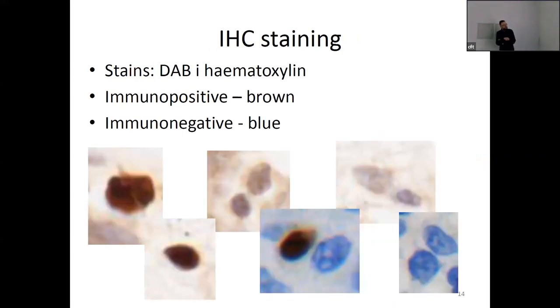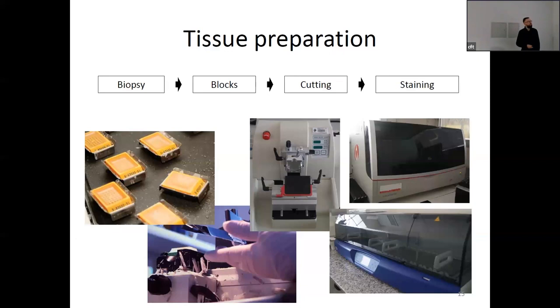And these are the samples from the images from my PhD that we have the stains of DAB, this is the brown marker, and hematoxylin, which is the blue marker here. So we have the brown and blue cells, but these are really zoomed in. We had a lot of them in the samples. I showed that later on. But these were the objects of interest for my algorithm to segment and to quantify in the slides.